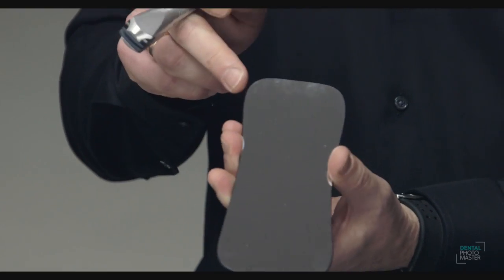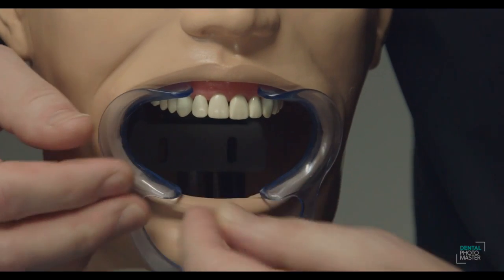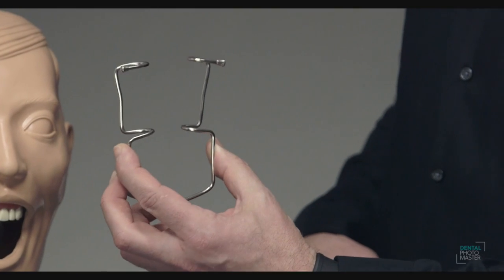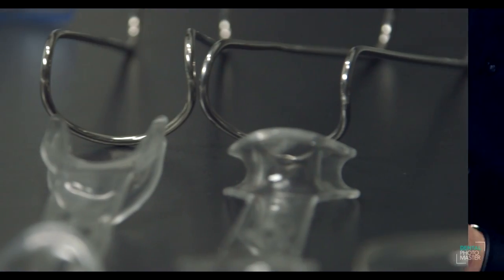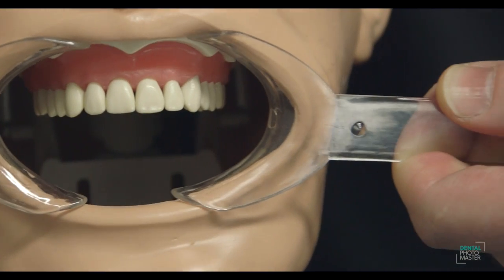I will show you the mirrors with different shapes and coatings, because they can be built in different ways. I will also explain and show the details and differences between retractors — they can be metal, they can be plastic, single or double-sided. I'll cover how to work with them and how to sterilize them as well.